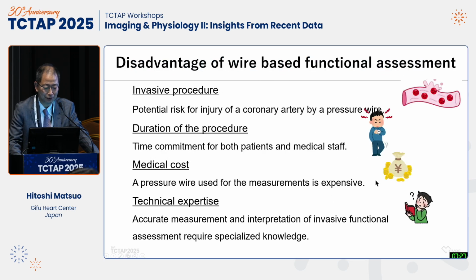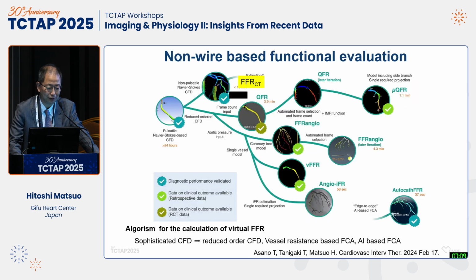This is a slide showing the disadvantages of wire-based functional assessment: invasiveness, duration, medical cost, and technical expertise. They all require the procedure of the FFR. And these slides show the development of functional coronary angiography. In our algorithm, we now have several indexes in clinical practice.